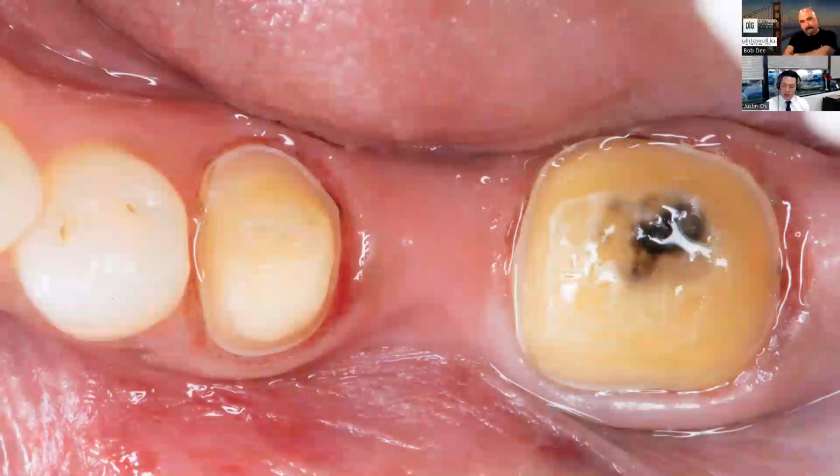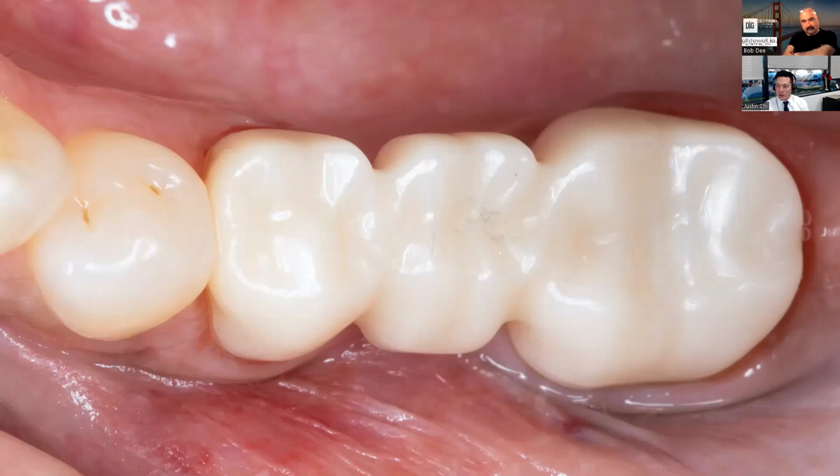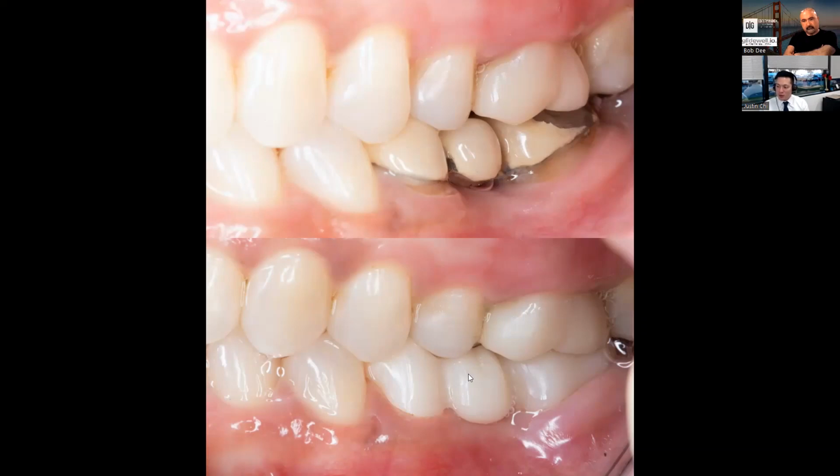So you saw the design. For this case, that little trick I mentioned about setting it as a premolar came after the fact. So this is what it looks like with a molar anatomy squeezed into that pontic site. Us as dentists and technicians, we may notice it, but for most patients, probably not. You can see a little bitty buccal groove there on the pontic.